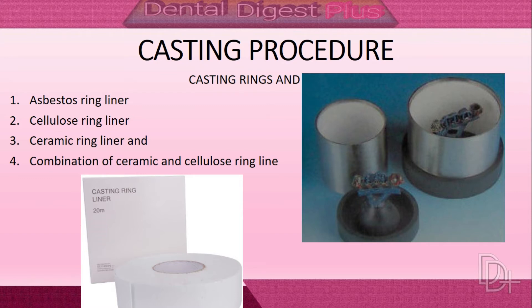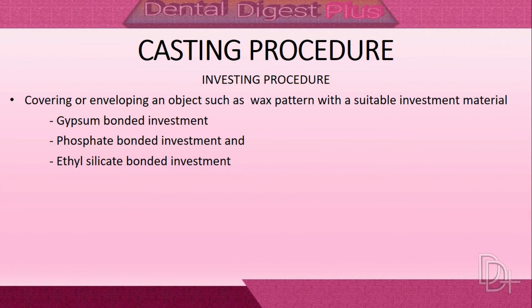Asbestos is no longer used in dentistry because of its carcinogenic and toxic potential. The casting ring liner acts as a cushion allowing expansion of the mold, permits easy removal of investment after casting, and reduces heat loss as a thermal insulator when the ring is carried from the furnace to the casting machine. To ensure uniform expansion, the liner is cut to fit the inside diameter of the casting ring with no overlap.